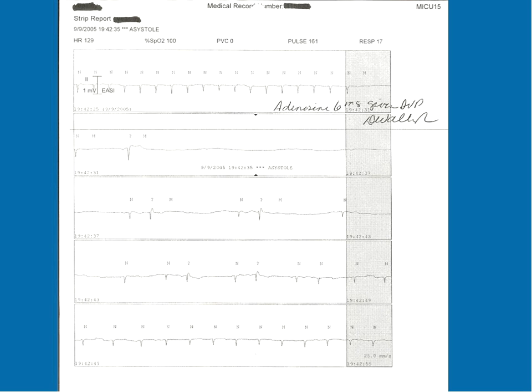All right, I mentioned that adenosine physiologically shocks the heart. Here's this patient with SVT, and right about here I pushed 6 milligrams of adenosine, and then I held my breath, because look, and then a long time of nothing. It basically produces some asystole until the half-life wears off. It feels like a very, very long time. It's not long. And then you can see here that the heart rhythm has resumed at a slower rate.